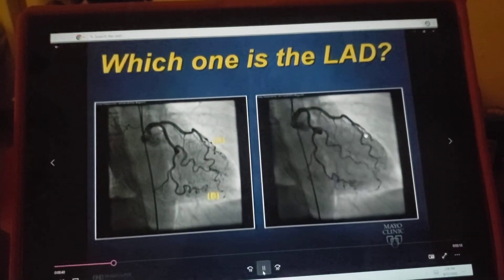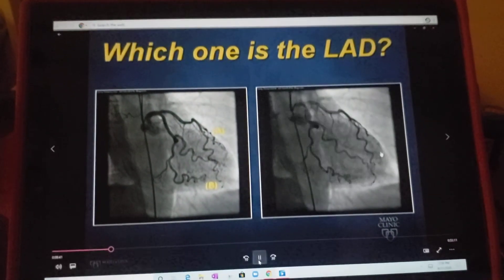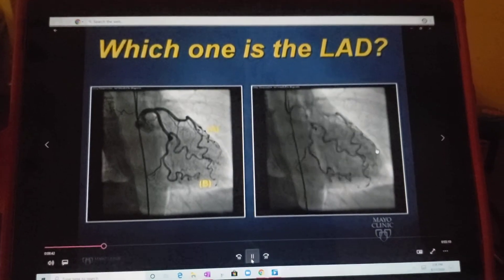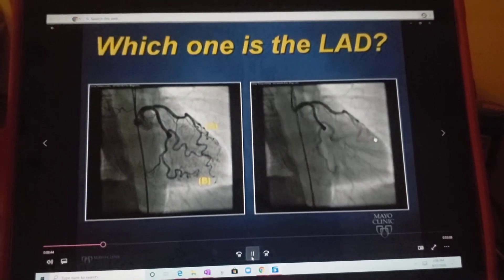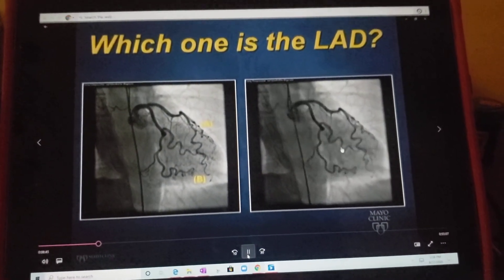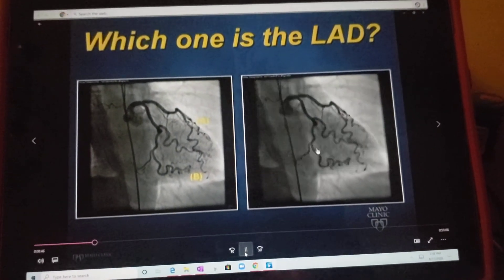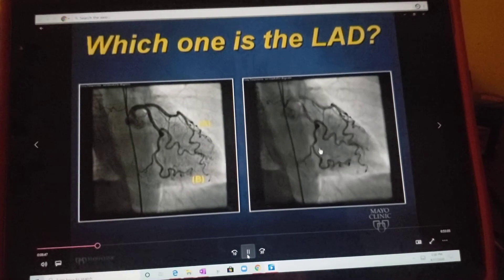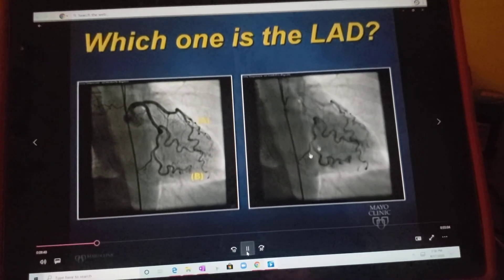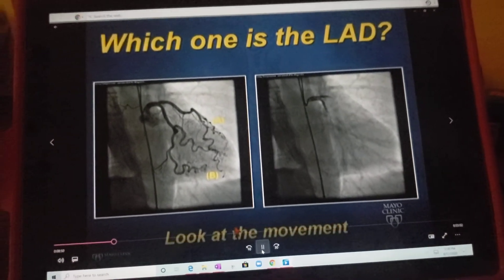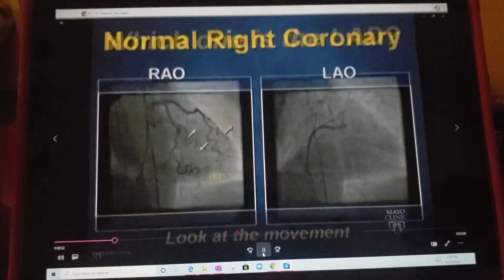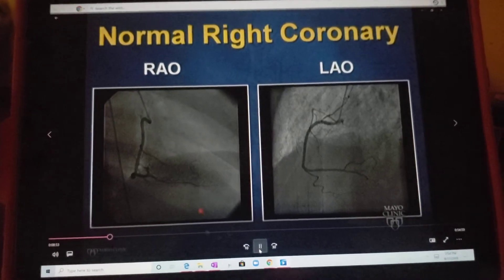Some people might get confused because they think this is going to the apex — this is in fact a diagonal branch. It's on the lateral surface, moving with the circumflex. Look at the movement. Opposite directions.